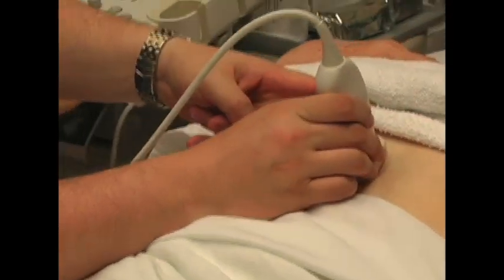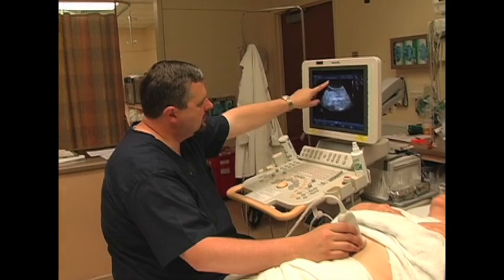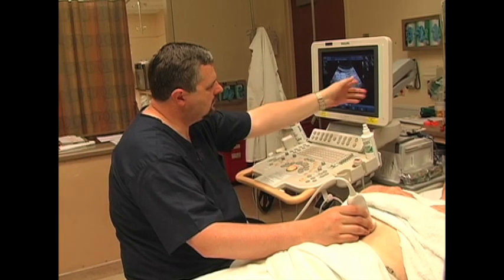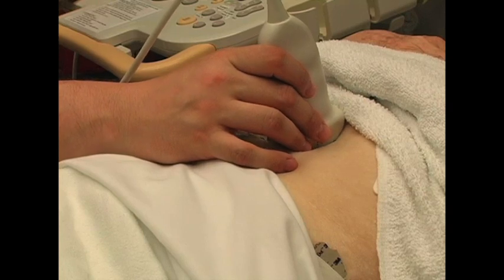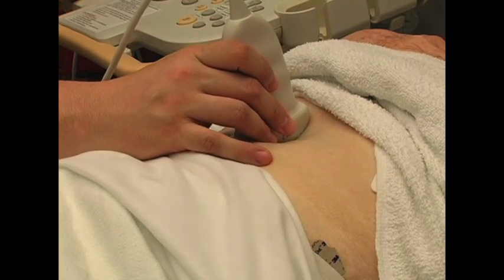The transducer indicator corresponds to the indicator marker on the ultrasound screen. So in the sagittal plane, the patient's head is to the left of the screen and the feet are to the right. We start with a transducer in the midline, just under the rib cage, and then sweep slowly towards the patient's right.